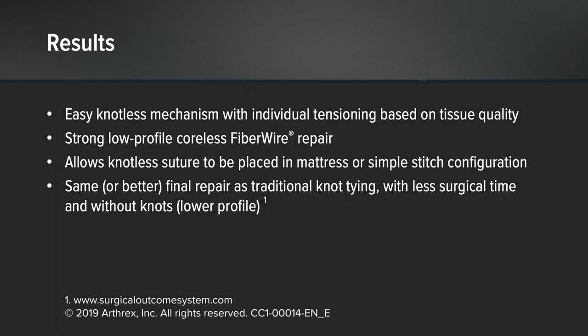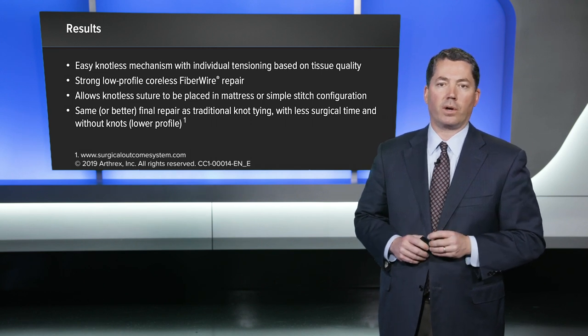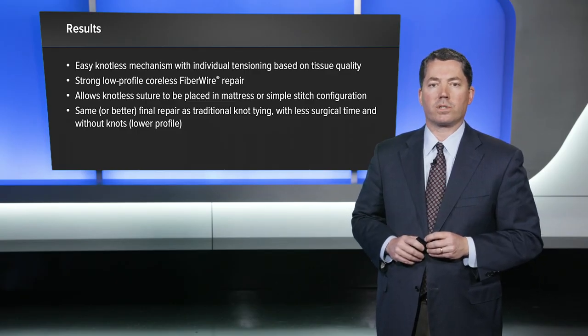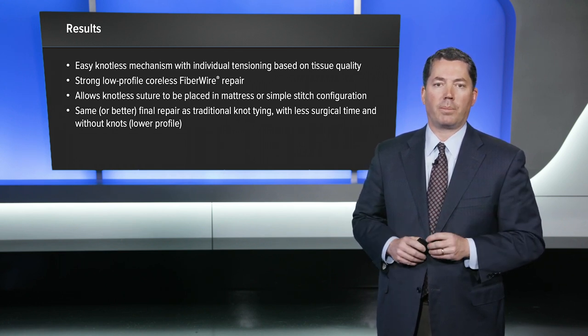For large labrum tissue in athletes you can really tighten this down and get good hard fixation. It gives you a strong, low-profile, coreless FiberWire repair with no knots, so there is no potential damage to tissue from knot placement. It allows for suture placed in a mattress or simple stitch configuration as shown in this video, and eventually gives you the same or even better repair than traditional knot tying — but with less surgical time and a lower profile configuration. Overall this is an excellent repair technique. I like the mattress and simple stitch alternating because of the healing response as well as the bumper that you restore, and I think you'll be happy with this repair.